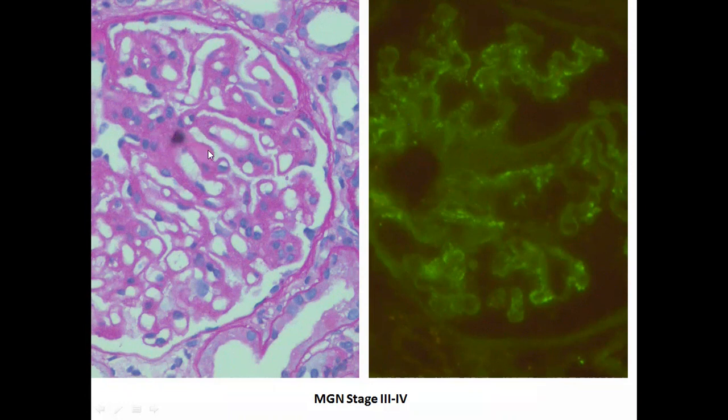Similarly, just see here. This looks more like hyalinosis rather than glomerular capillary wall thickening. So, advanced stage of membranous will show a significant thickening of the glomerular capillary wall. There could be glomerulosclerosis also. There could be tubular atrophy, chronicity also. And in these cases, you will find occasionally that immunofluorescence may turn out to be negative also. So what happens is, ideally, immunofluorescence has to be positive for labeling anything as membranous.